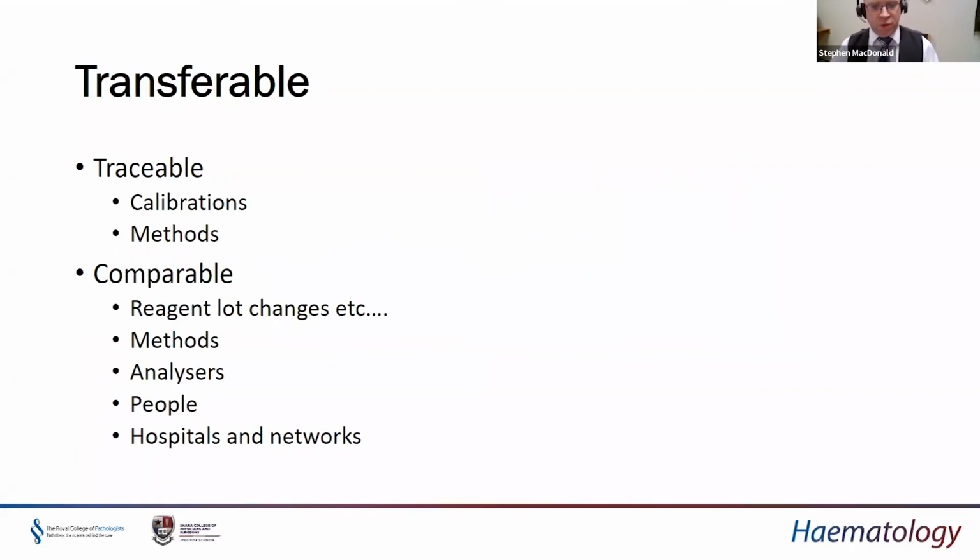We're coming to near the end now. So again, just to reiterate the part that I touched on earlier on about transferability of results being driven by traceability of calibrations and traceability of methods to reference methodology, so that we know that a result in a given center is the same as a result in the other center.